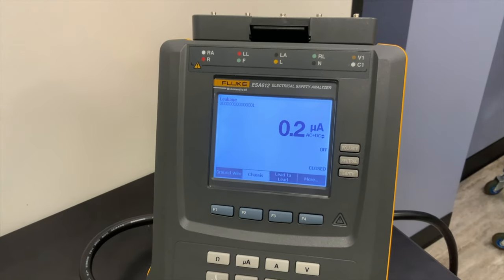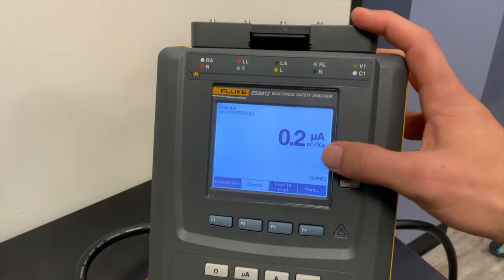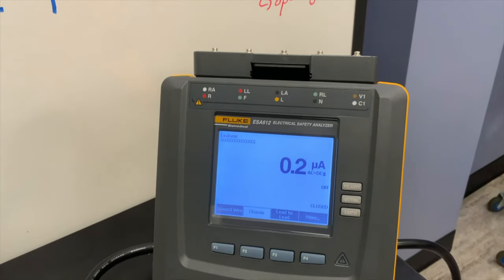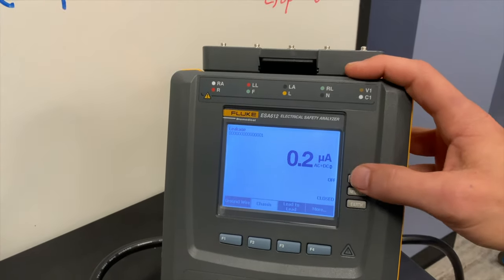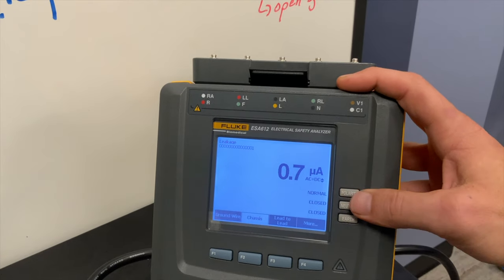We have to make sure polarity is set correctly — right now polarity is off, meaning power is actually off to this device. If I hit the power switch it's not going to turn on, so I have to turn it to normal polarity. We're testing in the no-fault condition and need to turn the device on and off. For a no-fault condition, we should get less than 100 microamps of touch current.